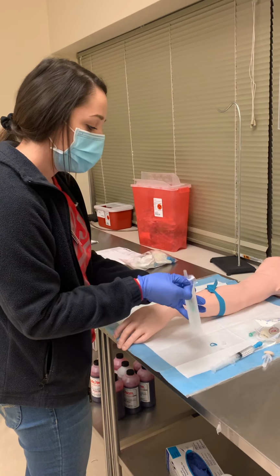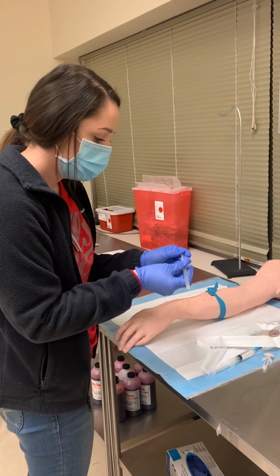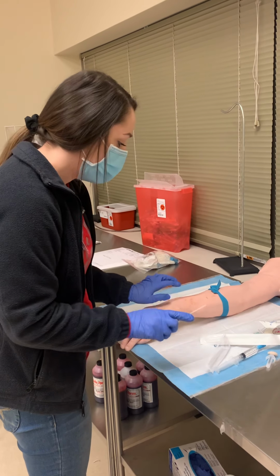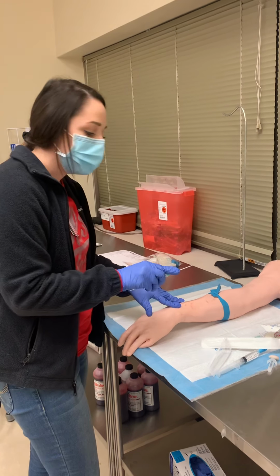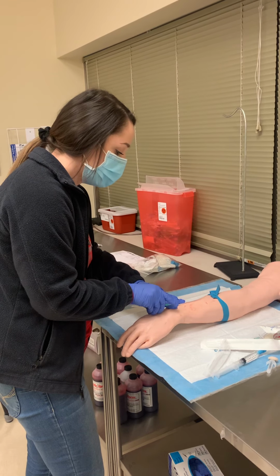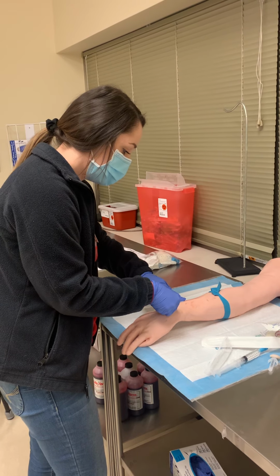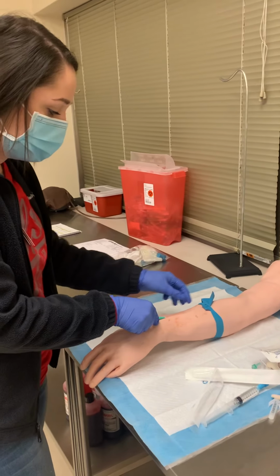Then prepare my needle. I would anchor the vein 4 to 5 centimeters below my insertion site. I'll keep the needle flush with skin and insert bevel up, and then perform the venous puncture. Observe for flashback.